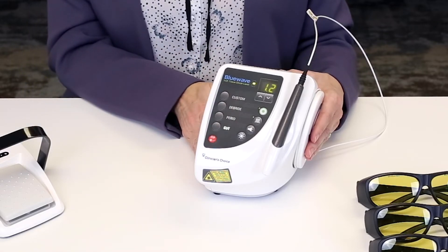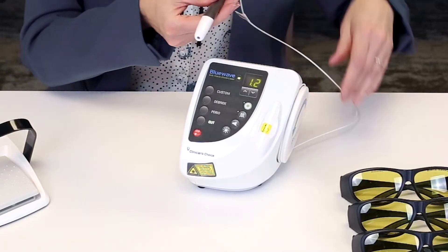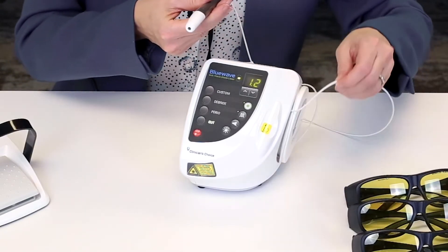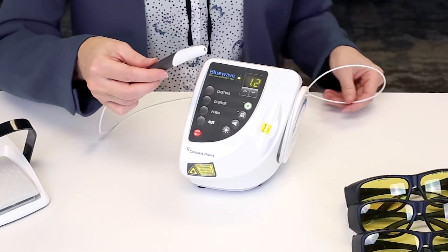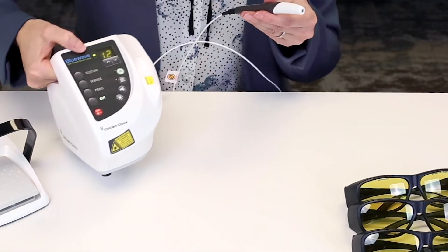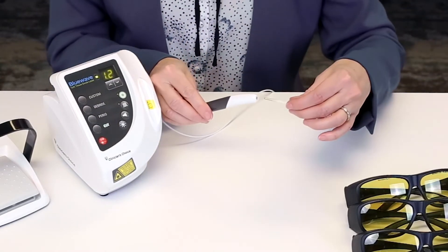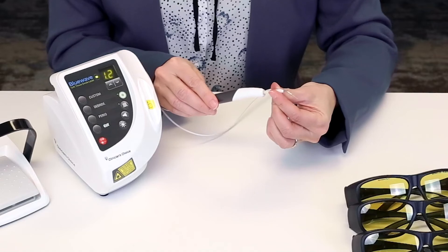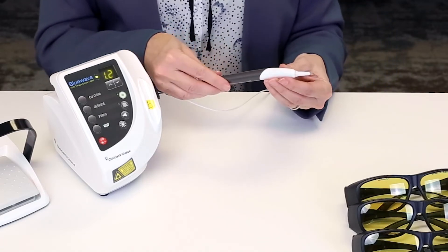Now you're ready to use the BlueWave laser. Take the handpiece out of the holder and unwind it very gently. Keep in mind that this is a glass fiber so you're going to want to be gentle with it. Then take one of the disposable single use tips out of the casing. Be careful not to touch the end — you don't want to add any contamination to it — and slide it into the unit.